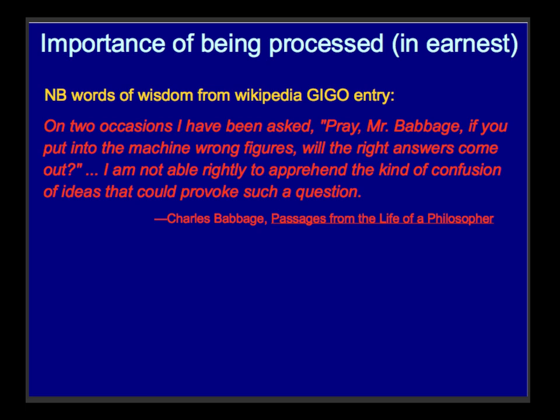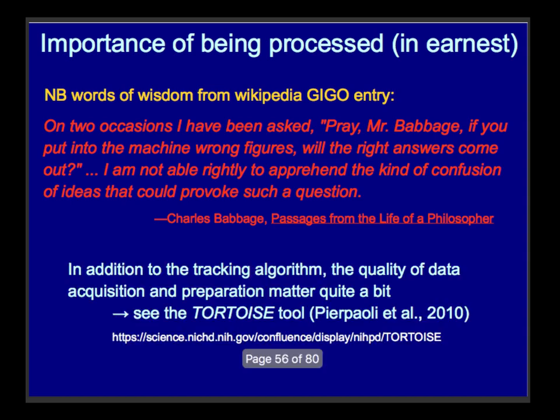And I really think this problem has only gotten worse today, because people just think, well, I ran it and my program didn't crash, so it must be good. This is just me on my soapbox. And part of the AFNI stuff as well, why we talk a lot about visualizing data. It really matters that you look at your data and think ahead of time about what you're going to get, because if bad stuff goes in, it's too complicated to compare every set of numbers along the way. So it's really important to be careful of how you process your data.